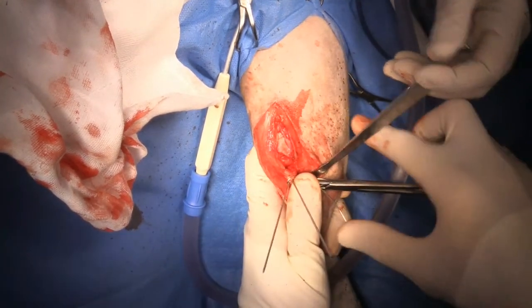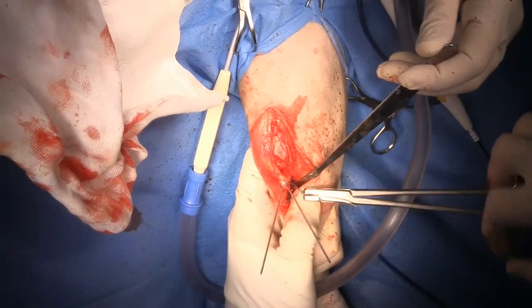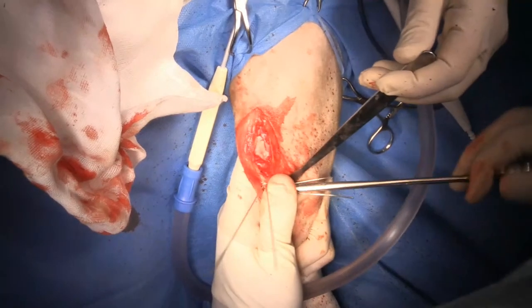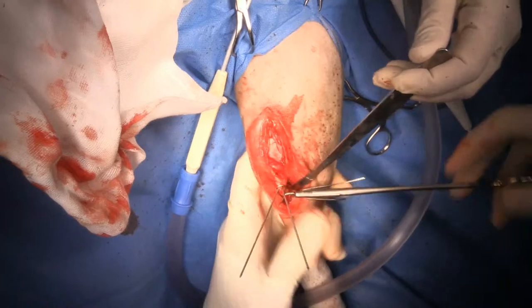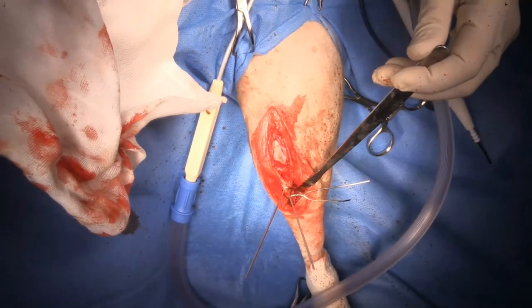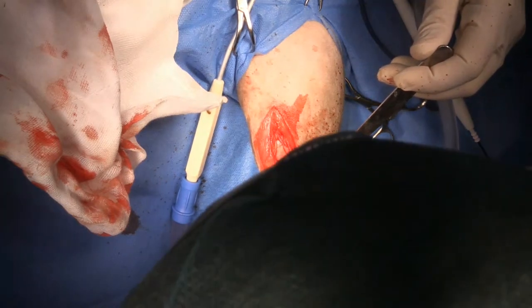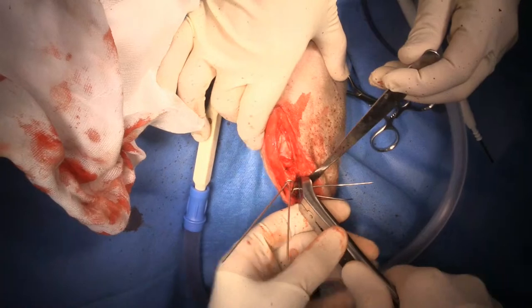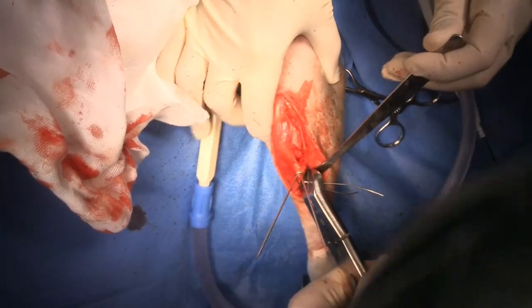The key when you are putting in any kind of cerclage wire is to keep tension on the wire as you twist it. I'll cut my wire leaving 3 twists in.